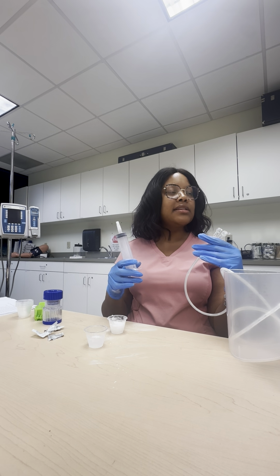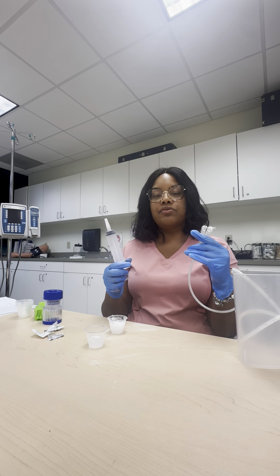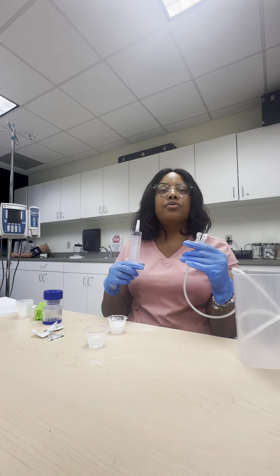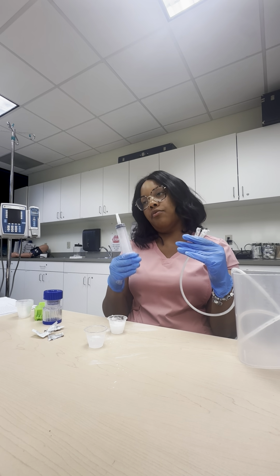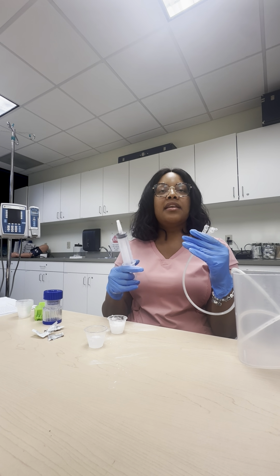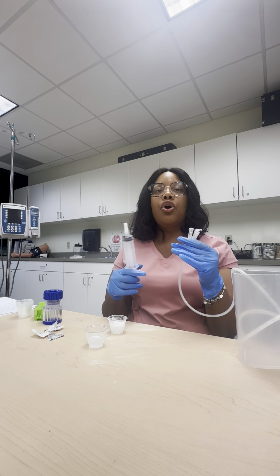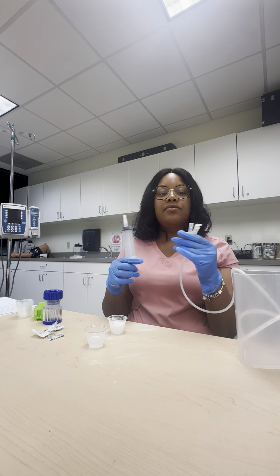One of the things I like to teach you guys is to get in the habit of checking your residuals, right? Different hospitals have different requirements, but I know that if a patient is getting continuous feeds, they want you to constantly be checking their residuals, maybe every 4 hours or something. So we're going to use this time to check residuals as well.